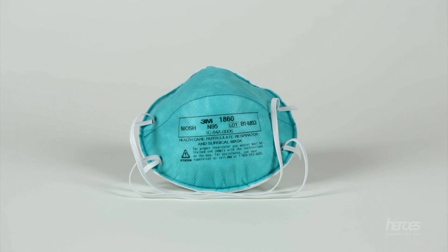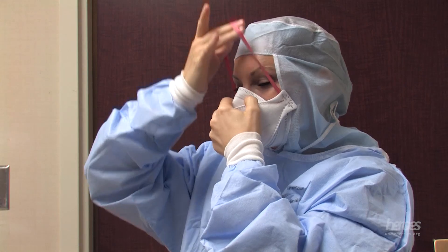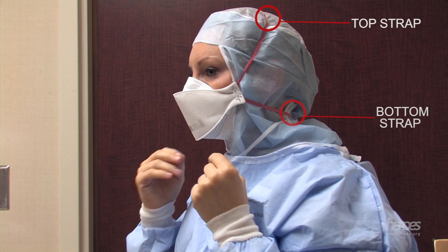The next step is respiratory protection. You should be using an N95 respirator. The blue style masks have been causing skin breakdown on the nose, while the white tri-fold style N95 masks have been found to be more comfortable for long-term use. The mask should be sealed to your face to ensure a proper fit. Correct strap placement is vital — the top strap should be located at the crown of the head and the bottom strap at the base of the neck. Make sure the straps are not crossed, as this may cause the respirator to shift during patient care. Finally, perform a fit check by breathing deeply in and out, feeling for any air leakage with your hands.